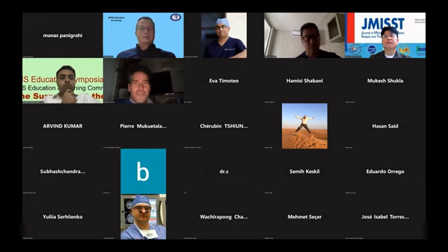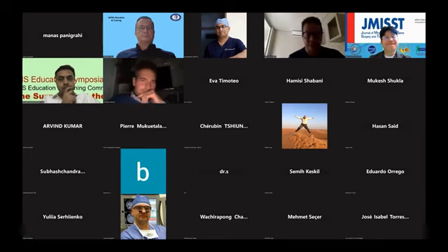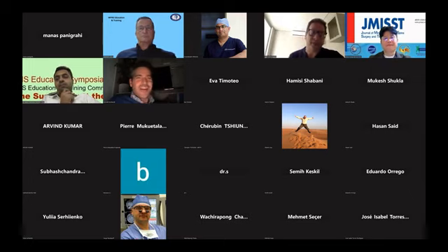It's just that simple. If you look at the literature, a tube-based or microsurgical procedure has high success rates. That's what you have to compare this to, and you can perform outpatient procedures. This was my last slide. Not using an endoscope, that's been done in the US all the time. But there are many physicians, for example in the USA, who perform everything with fusion. If you compare endoscopic spine surgery with that kind of treatment, we offer a cheaper version of treatment than the older ones.